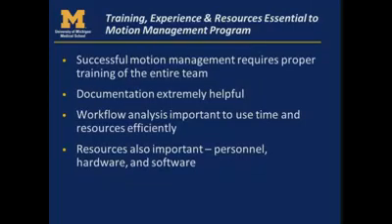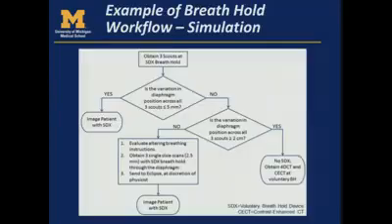One thing to mention too is training and experience and resources are really essential for a motion management program. You need proper training of the whole treatment team, documentation, and workflow analysis to make sure you're using all of your tools in an efficient way. And making sure you have the right personnel, hardware, and software to do these abdominal treatments in a safe way with motion management. And so this is just an example of our workflow for simulation. This is something that Christy Brock put together.